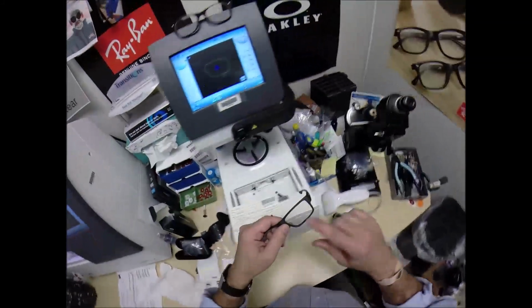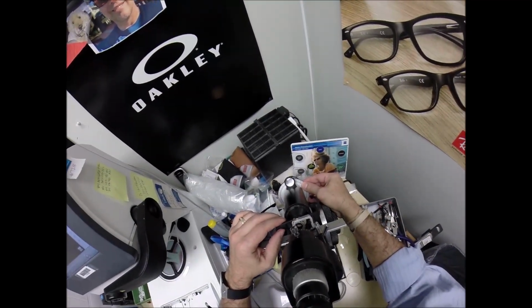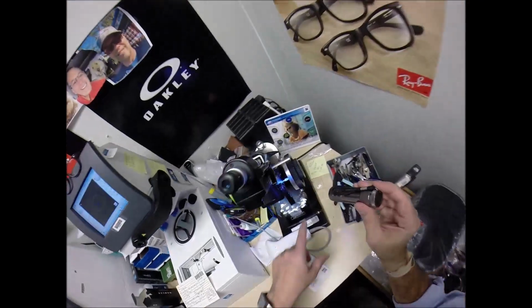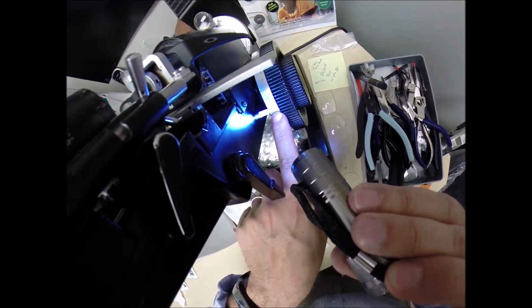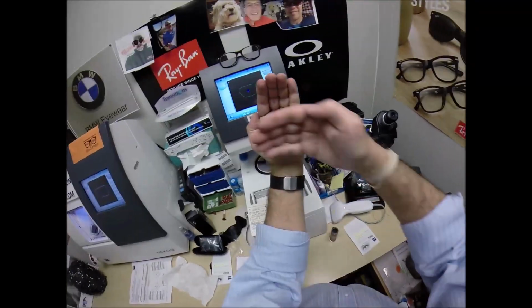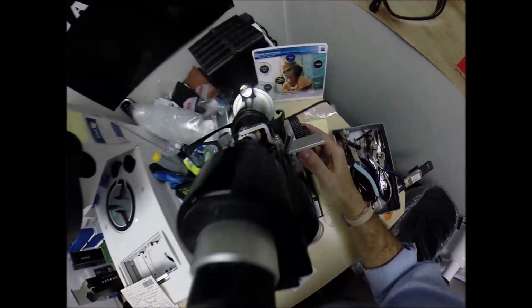Come down here to the lensometer. That dot is still there. Put it in, turn the axis wheel to 86, which corresponds with your astigmatism correction. Read the power, and I am getting minus 75, going away from 0 into the minuses in the red. We stop at 75, one tick mark away from 1. You have a curvature on your eye, -75. Your astigmatism is a steeper curve, 90 degrees away. And it's how we line those two curves up to make everything nice and crisp.